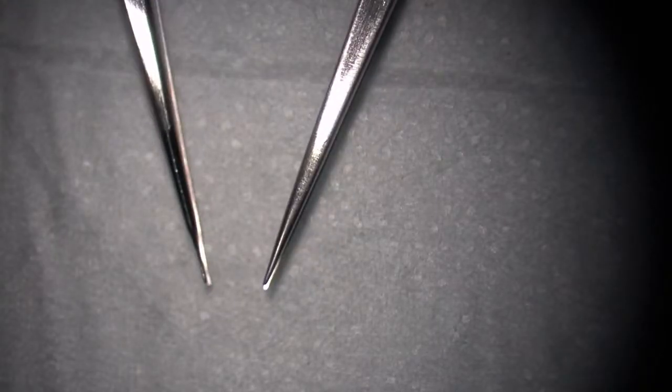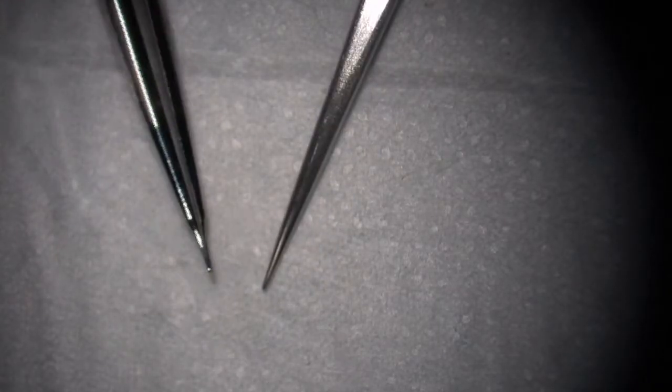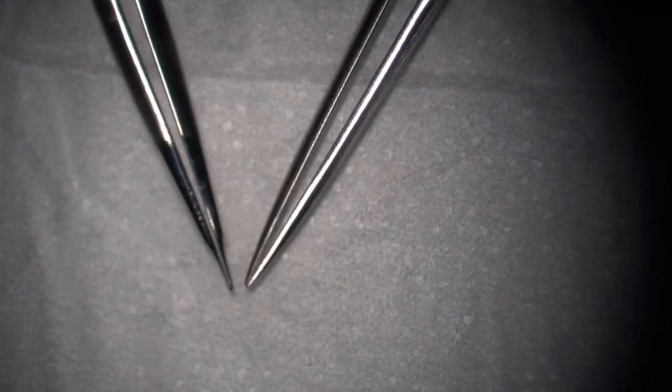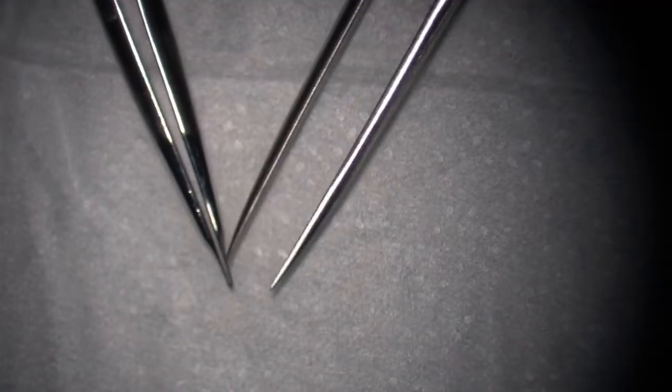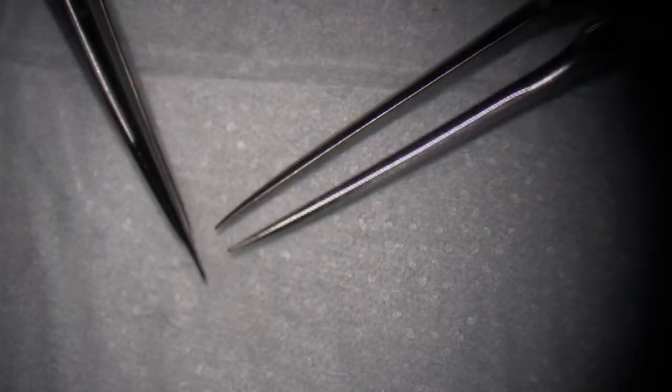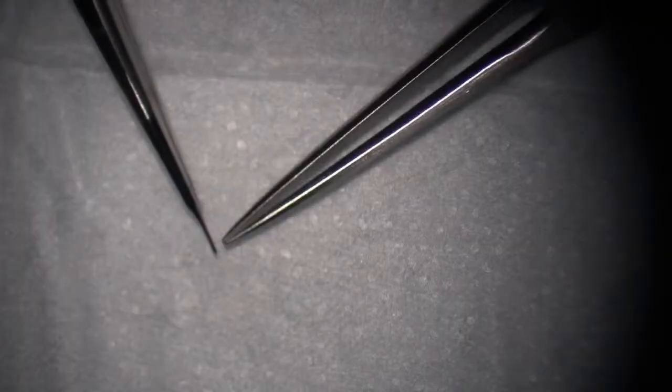Now take a look at what's the difference between these two. It's the slope it's coming at. This is a straight shot. This one is not coming at a true angle for the tip, but starts at some degree of angulation. And take a look at the tip. It really narrows down at the most distal portion and meets together. With this one only the tip can touch, while this one can touch a segment of the tip. Also you can see it's pretty smooth, sliding.